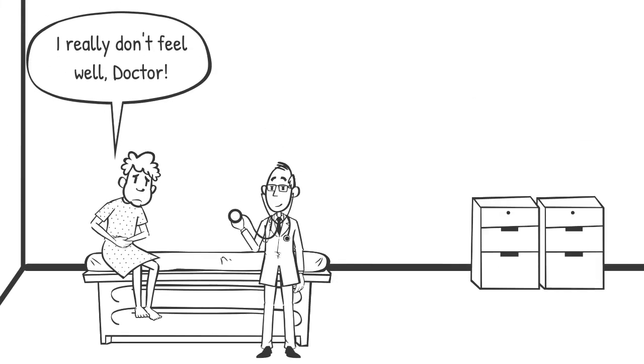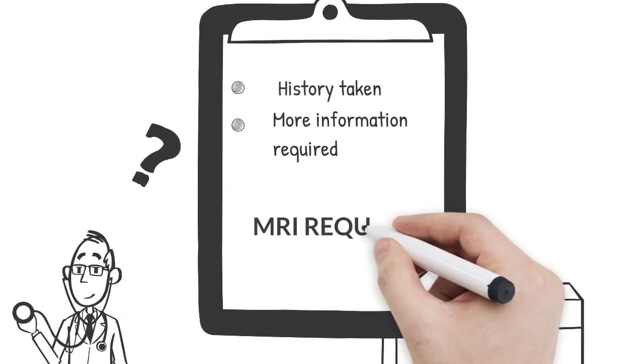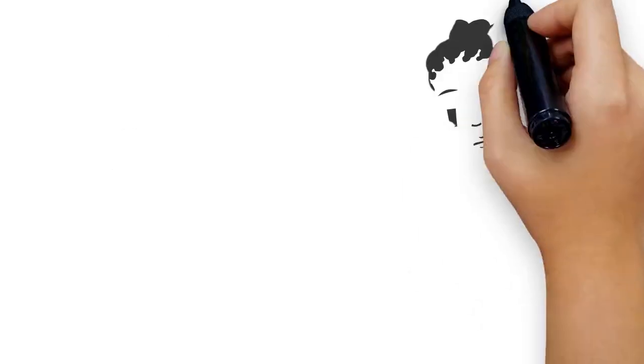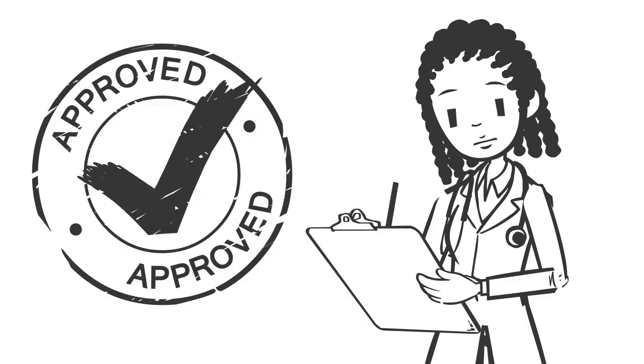You may have been referred for an MRI because you are feeling unwell, because your doctor wants to follow up some test results, or maybe as part of a screening or research program. You have been referred for an MRI because a healthcare professional who has reviewed your clinical history has decided that they need additional information, which can be obtained by using an MRI scanner to look inside of you. Before the MRI scan goes ahead, an imaging specialist will look at the request and decide whether it is the right test for you to have to find out why you are feeling unwell. They will then pass the request on to a highly trained radiographer to carry out the scan.